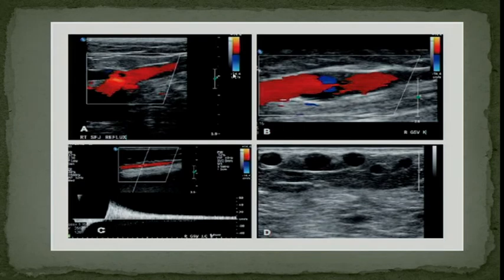That's fine. This patient has reflux, but she will still sample and give you one spectrum to confirm it because with this, we cannot tell you the grading of reflux, right? We cannot tell you how many seconds it was refluxing, so she will give you a spectrum telling you how much it was refluxing. Laura, what is the grade of reflux here? Severe. Severe, very good. If this is about several seconds it was refluxing, right?